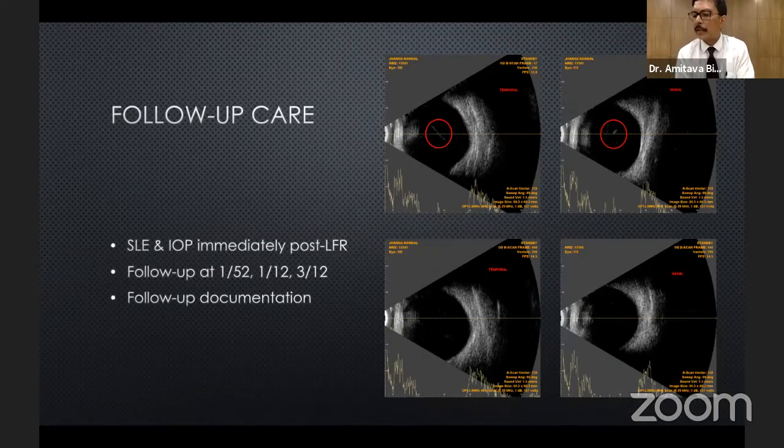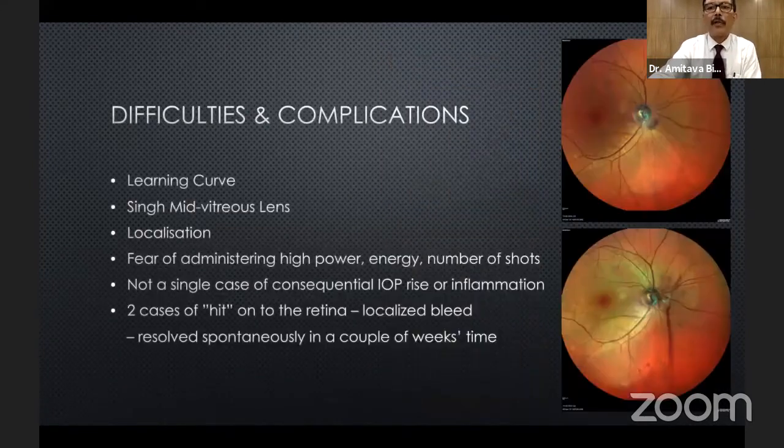Okay, so there was another question from Dr. Madan Mahapatra, whether the floaters disappear totally or not. Well, in a large majority of cases they disappear totally, but it also depends on the size, the density, and the extent of the floater. The important thing is whether it is causing any visual disturbance or affecting quality of life. In most cases, the patient is free of the symptoms.